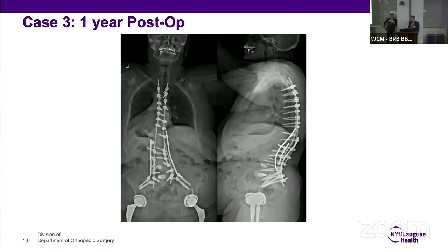No, but can you tell the software that to make sure that, let's say, the screw heads are aligned, or do you have to manually plan every screw yourself? So I have my fellow do all the planning, and then I come in and change it so that everything lines up, and I look at it to make sure that they're aligned. So I still do it manually. I'm just wondering, it would be nice if the software would just give you that option. I'm sure there are some people working on that. All right, any other questions or comments?